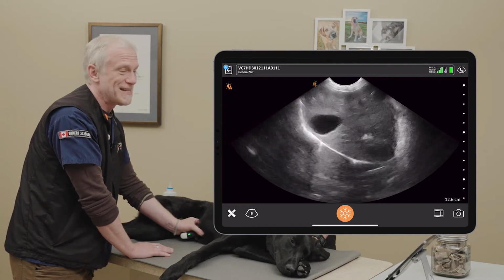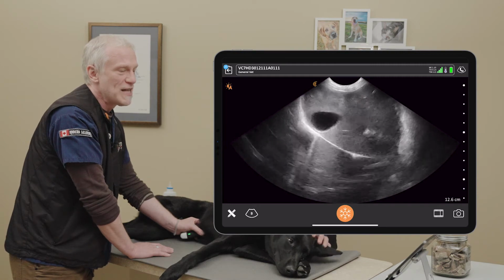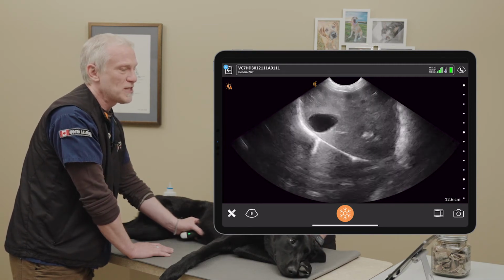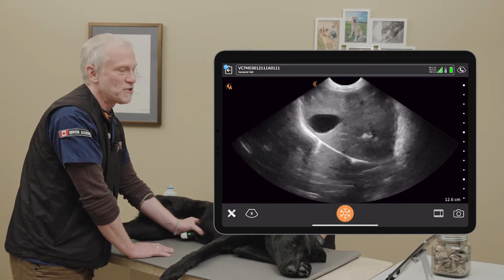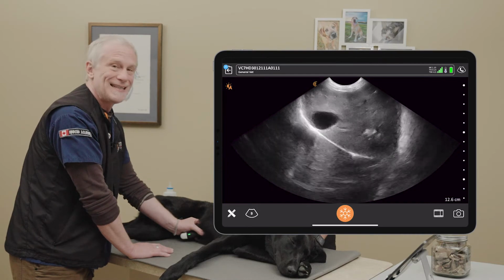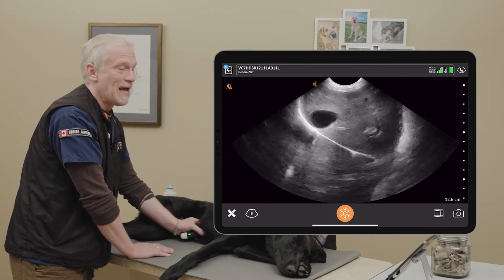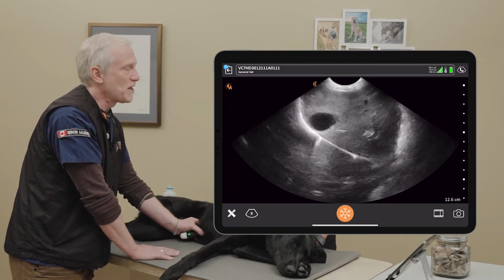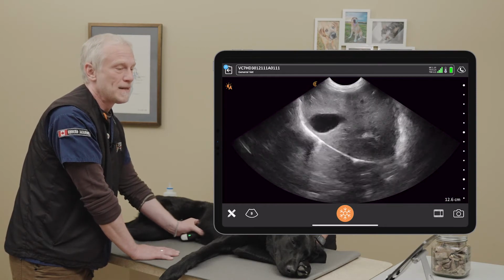As you mentioned, Dr. Schlub, we can see the bounce here, so the cardiac pulse. That is a normal finding. We lose that when they get volume overloaded. We can also see that the diameter, the distance between the walls of the vena cava, gets narrower on inspiration versus expiration, and we expect to see at least a 25% change in the diameter of that vena cava at this location. And that's basically used for us to determine, can we give this patient a fluid bolus? Is our patient fluid responsive? Yes or no.